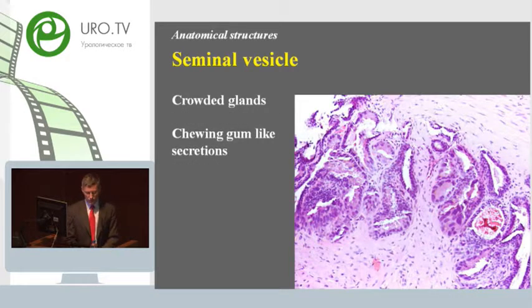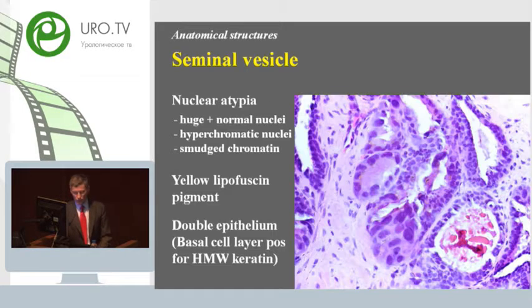The problem is that you have small glands that have nuclear atypia and also thick secretions. And this resembles prostate cancer. The nuclear atypia can be very, very pronounced. So this is sometimes misdiagnosed as prostate cancer.